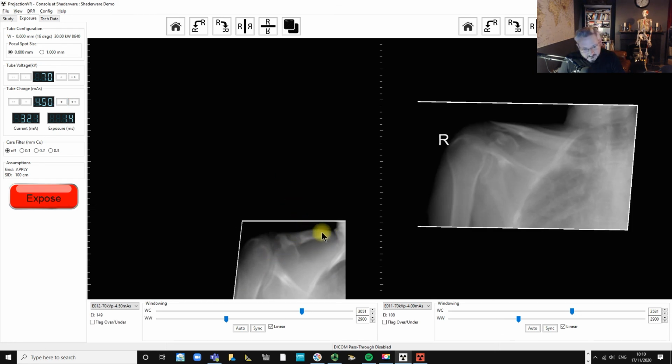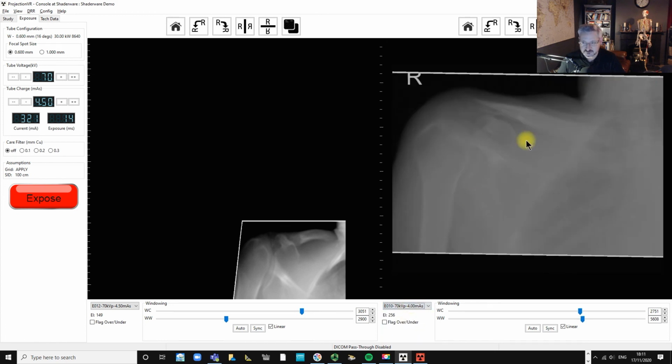So you can see we're really seeing under the clavicle here, but we're only seeing the lateral aspect of the clavicle. And we can see the coracoid process as well. So this is an axial clavicle, and it has been used in the past to get an even more radical image, to see whether there's any forward or backward, anterior-posterior shift to the fracture.